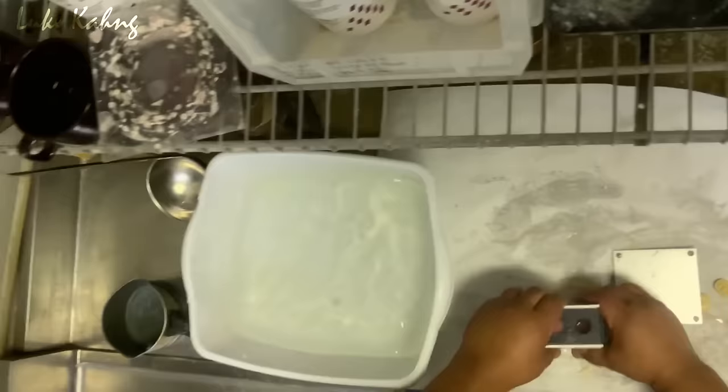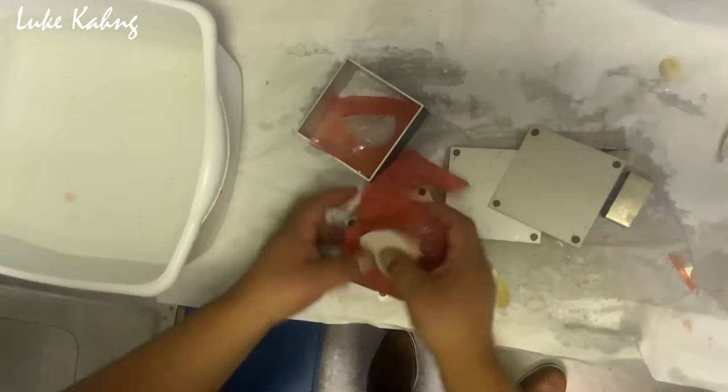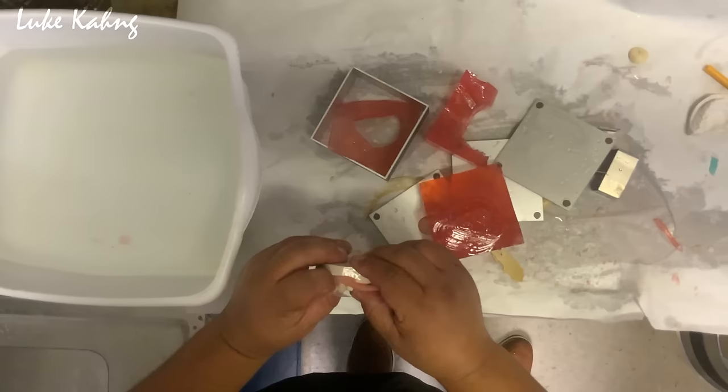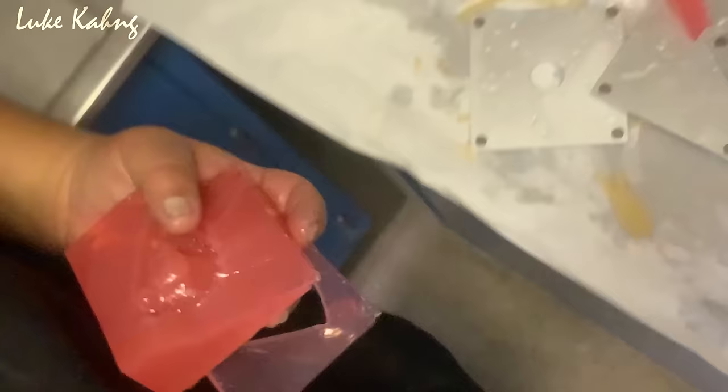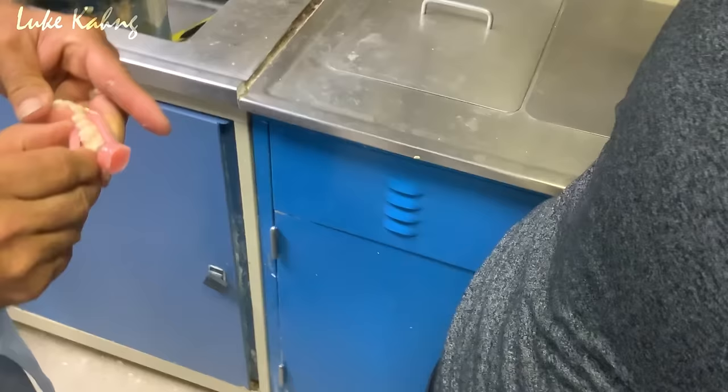Yeah, when it's elastic, it's better to put it in water a little bit because it can distort a little bit. Just finish it, don't you? Yeah, I need it a little bit more quickly, but it's okay.